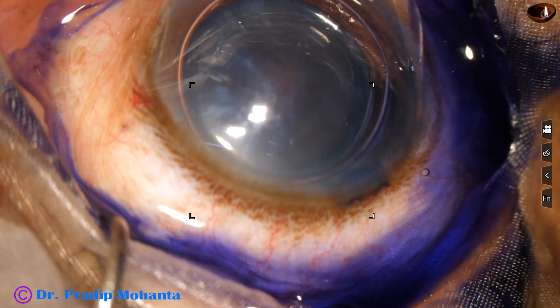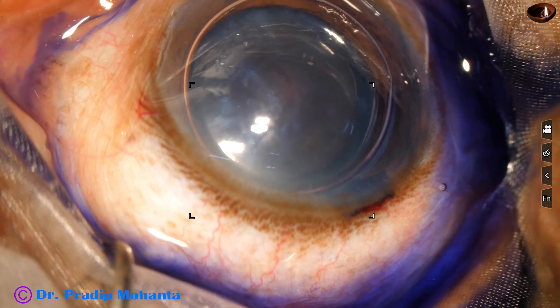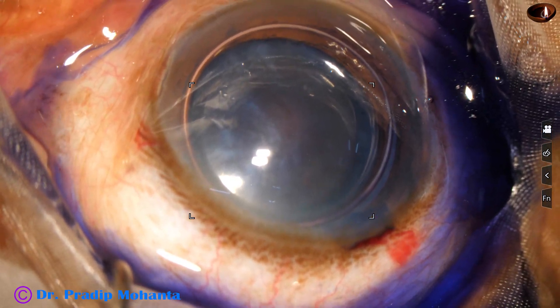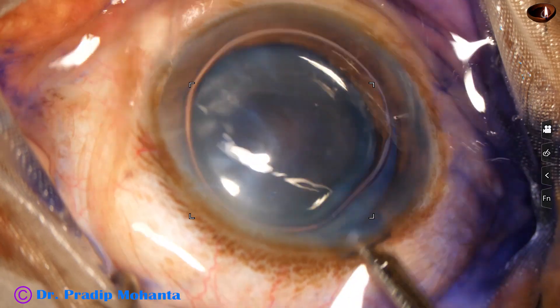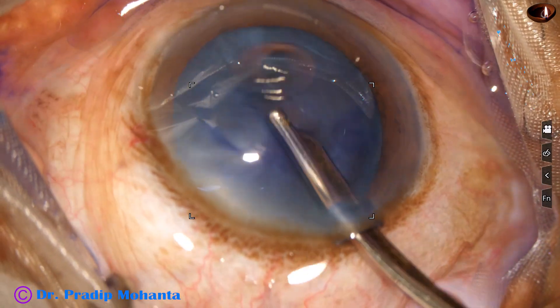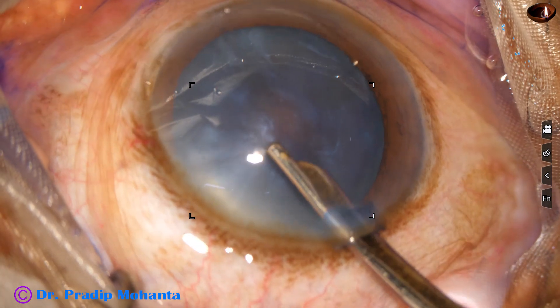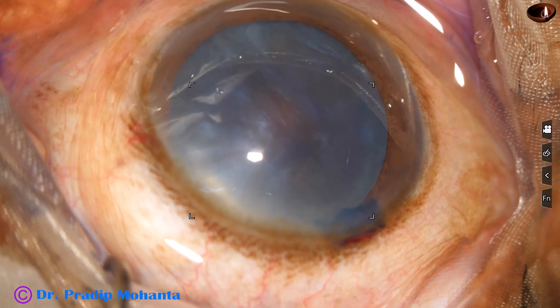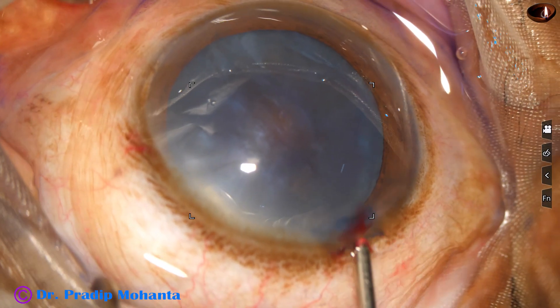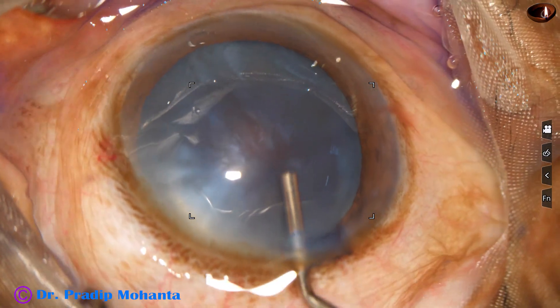Because of local anesthesia — because of peribulbar block with lignocaine — the eyeball has tilted to the right side. Sometimes it happens. This is because some of the muscles are paralyzed more than the other muscles.